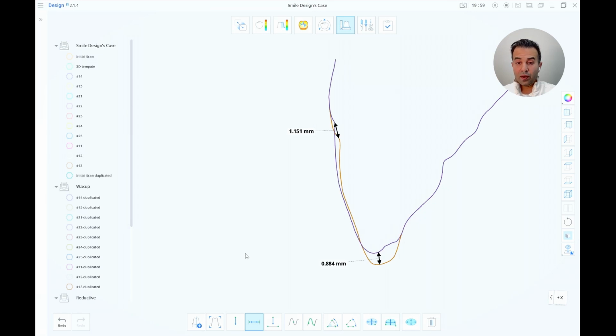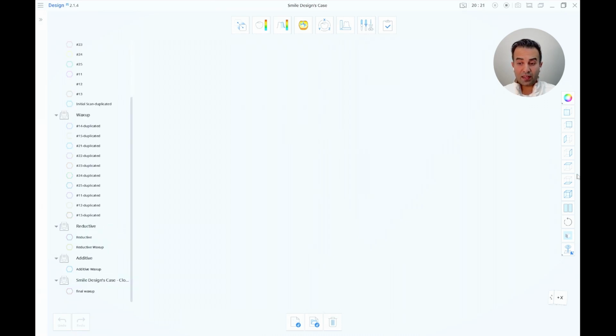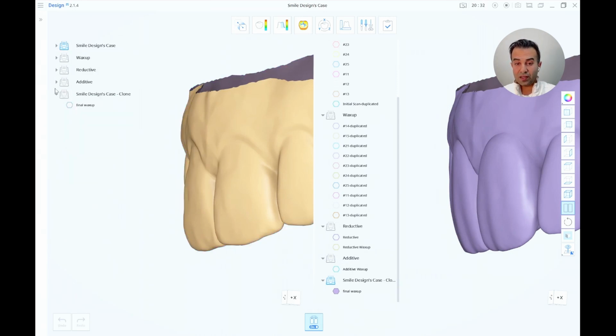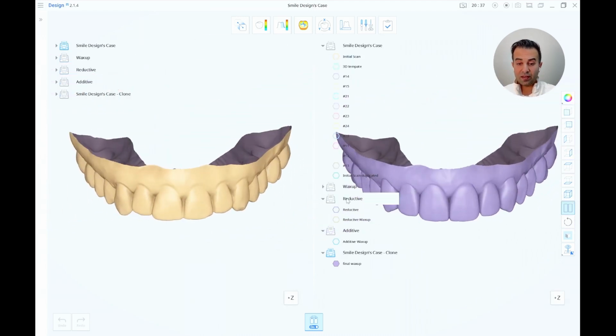So that's how easy to use these tools are, and they are so precise, and that's why digital dentistry has changed the way I practice. I really hope that every dentist who is passionate about giving the best to their patients will learn these tools, as obviously there is a learning curve. The sooner someone can master these tools, the better they'll become. Digital dentistry is not the future anymore, it's the present, and we practice it every day.